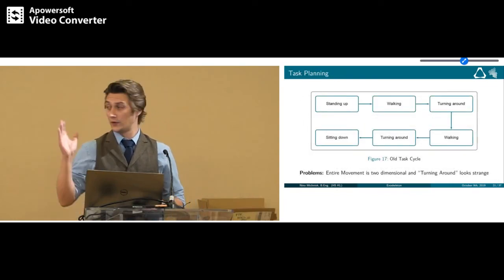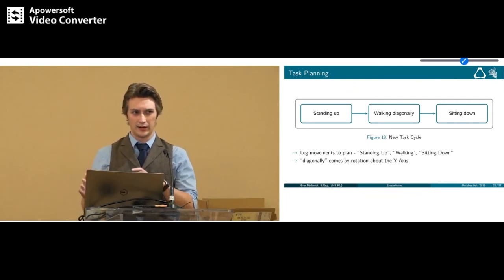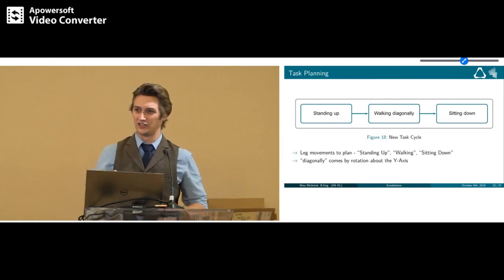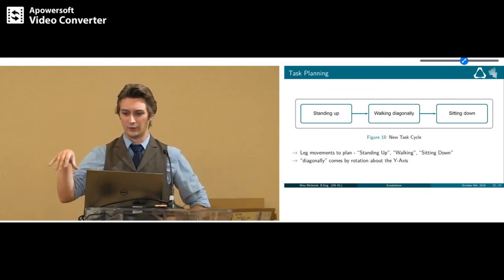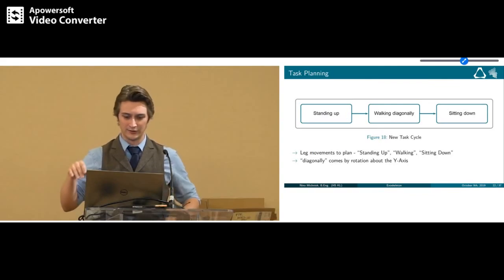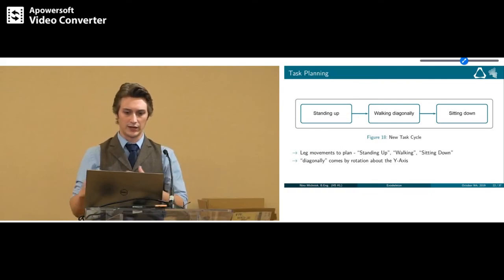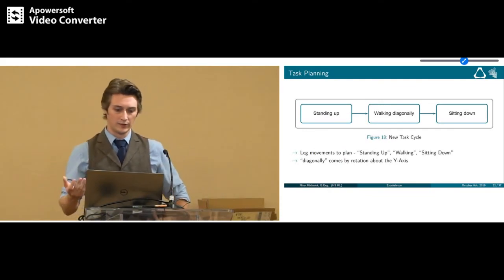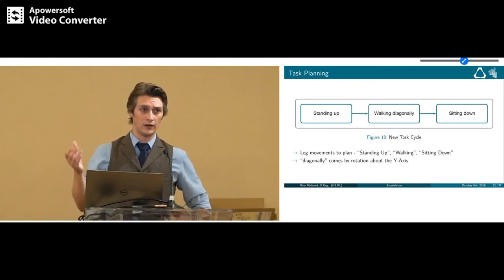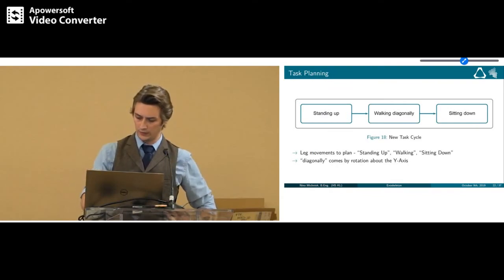To the task planning, this was the old task cycle, which I've already shown you. And I had the problem that the entire movement was two-dimensional, and he was always walking on a straight line, as you've already seen. And the entire turning around part looked really strange to me, because of the stepping up and downward on this point. So I decided to change that a little to standing up, walking diagonally across the floor, and sitting down at the other corner of the room. So the leg movements I had to plan were simply standing up, walking, and sitting down. And the diagonal part again comes by an external rotation about the y-axis of the entire system.